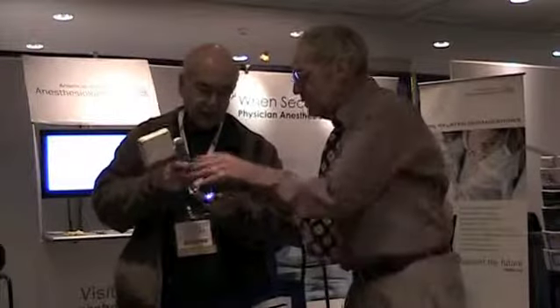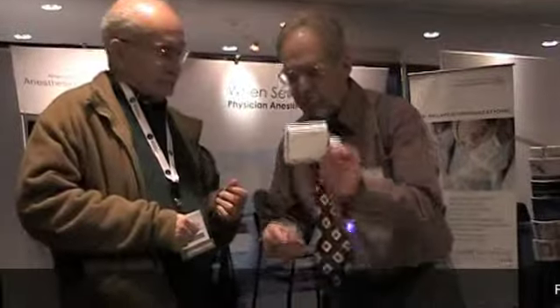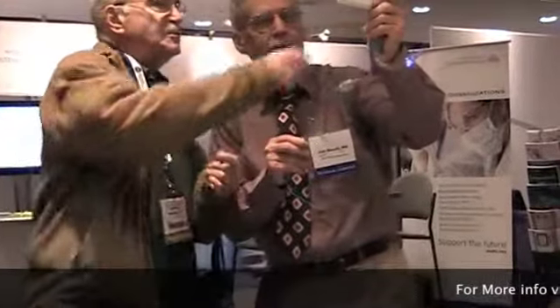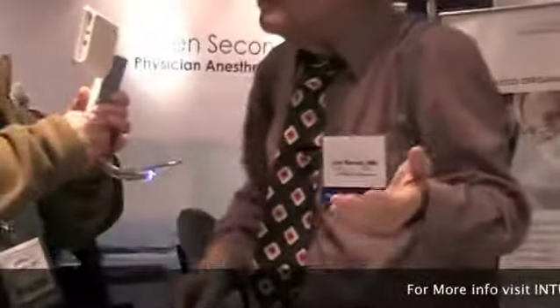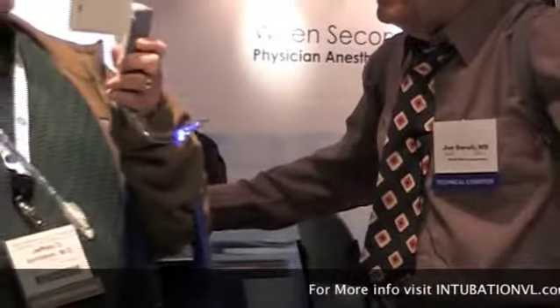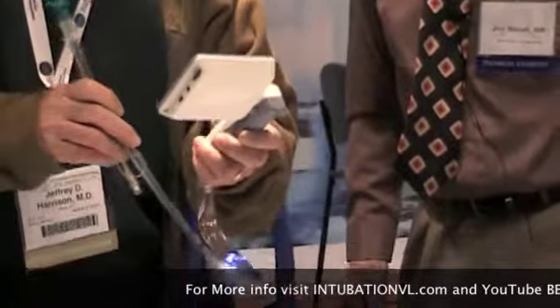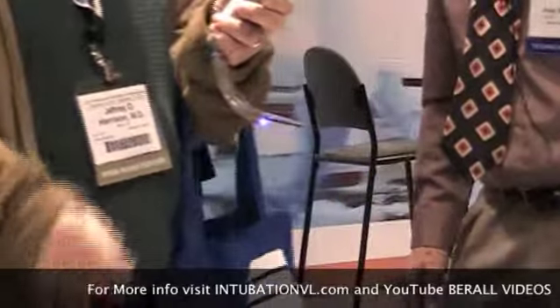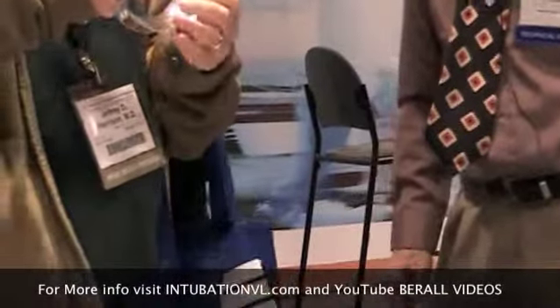See how does the tube go in? It's your standard approach — it's a Mac 3. It's essentially a Mac. It is absolutely a Mac. So you pick a target, boom — that's interesting. It is a Mac.